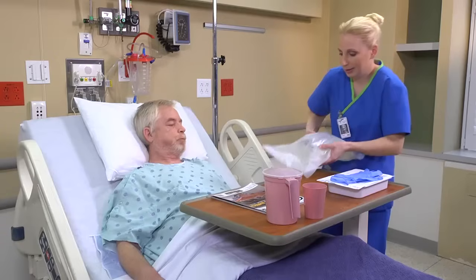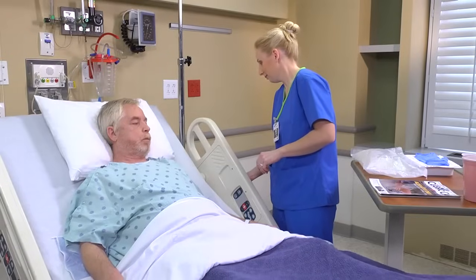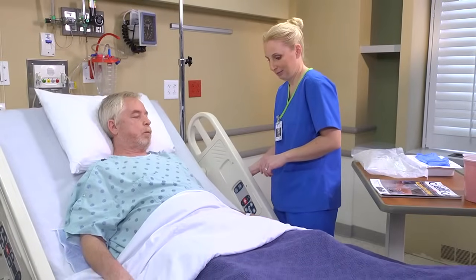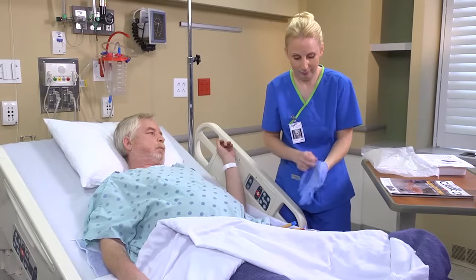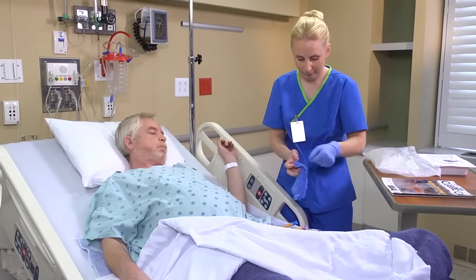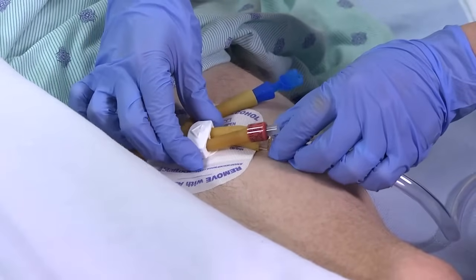Before you begin the irrigation, organize the supplies you'll need for the type of procedure ordered. Raise the bed to a comfortable working height. Expose the junction of the urinary catheter and the drainage tubing and put on gloves. Then remove the catheter from the securement device.